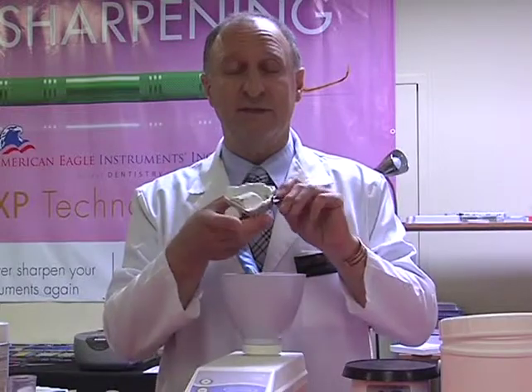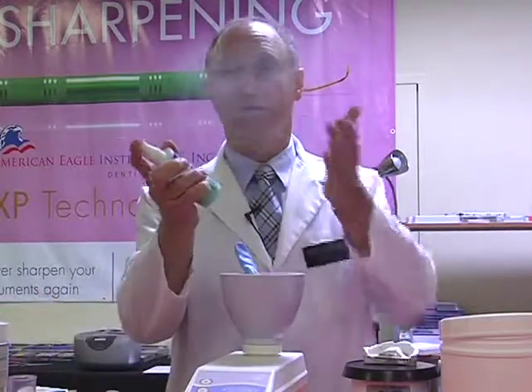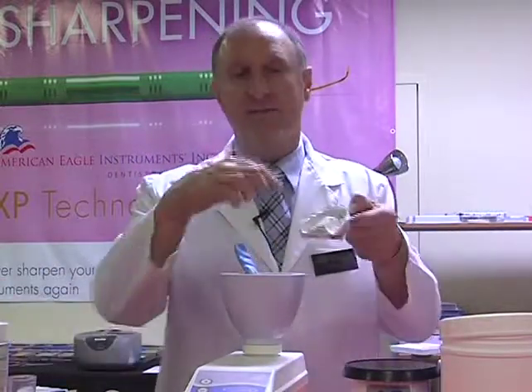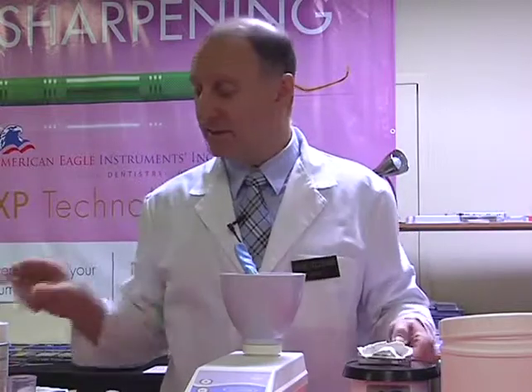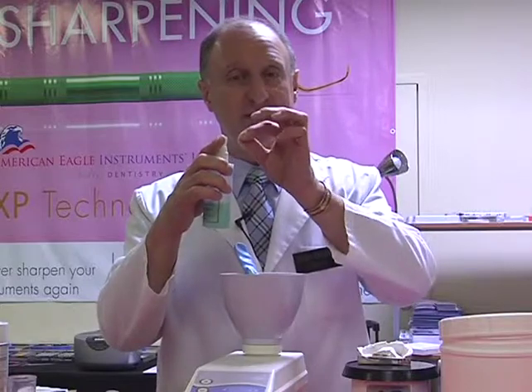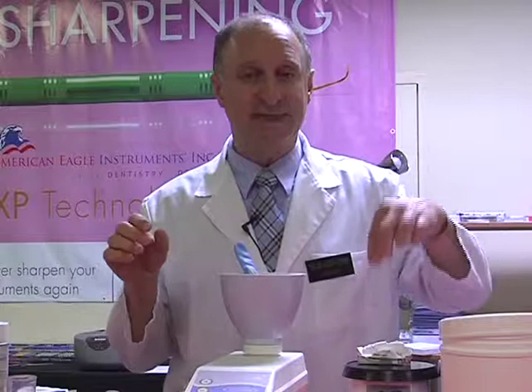We'll spray it with a disinfecting spray, but making sure that if it's a very fine spray, there's no way that a fine spray will reach the bottom part, especially for lower anterior teeth that are long and narrow. So if it's possible on a sprayer and it has a chance of changing the coarseness of the spray, do so, because we want to have large particles that are entering down inside.